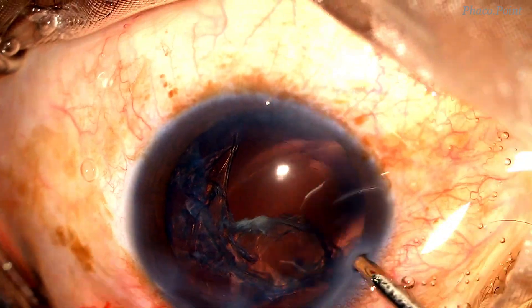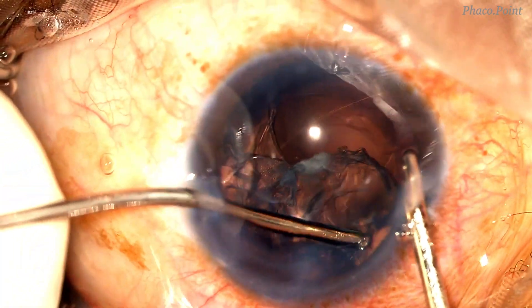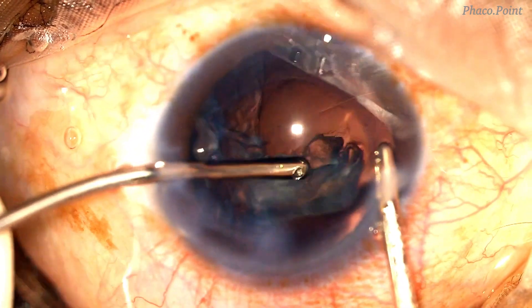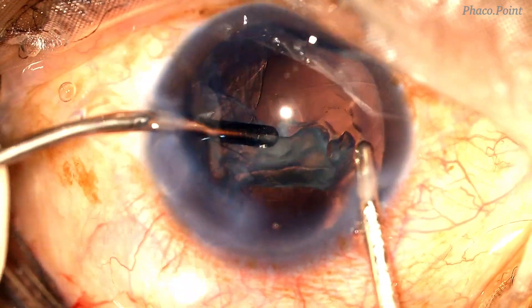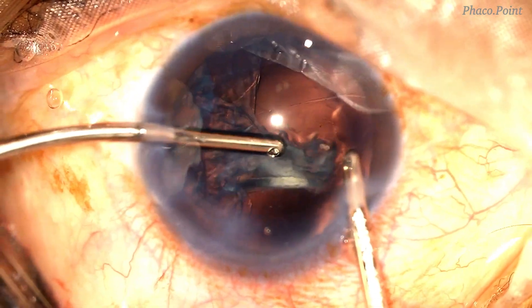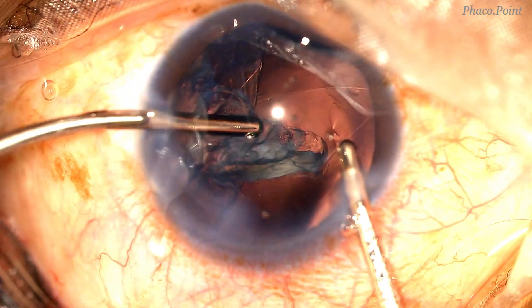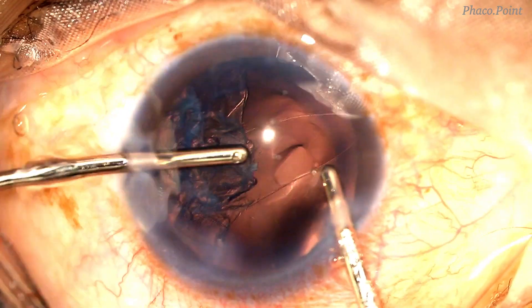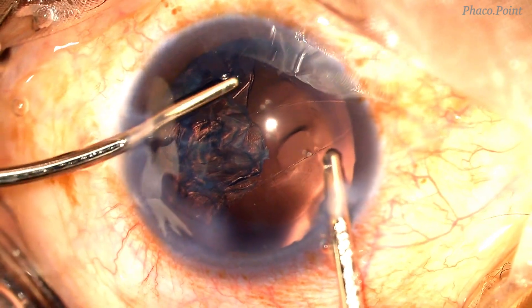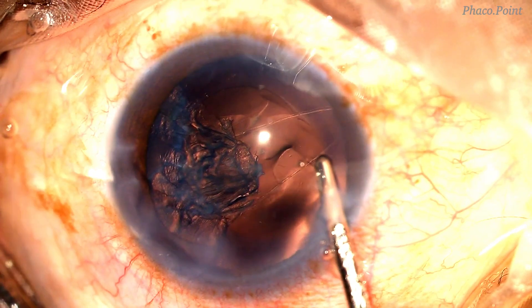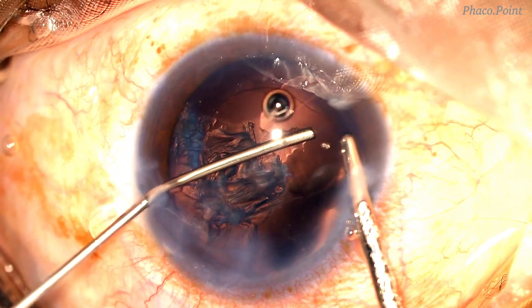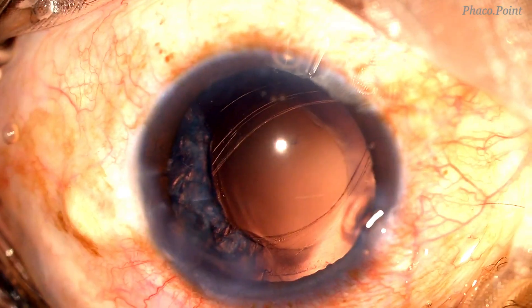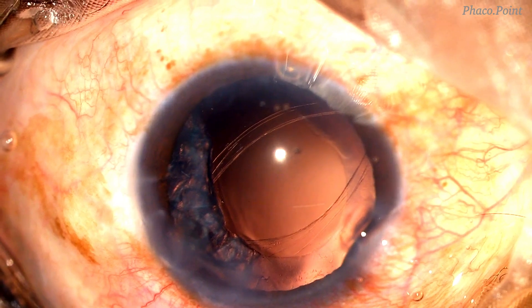Let's now watch the cortex wash. With care and caution, maintaining the irrigation facing the angle at all times to prevent vitreous hydration and herniation, the cortex is aspirated. Once the right half of the cortex has been removed, the aspiration is removed from the eye, a visco-fluid exchange performed, the irrigation is then removed from the eye, the hands swapped over, and then the rest of the cortex is aspirated.